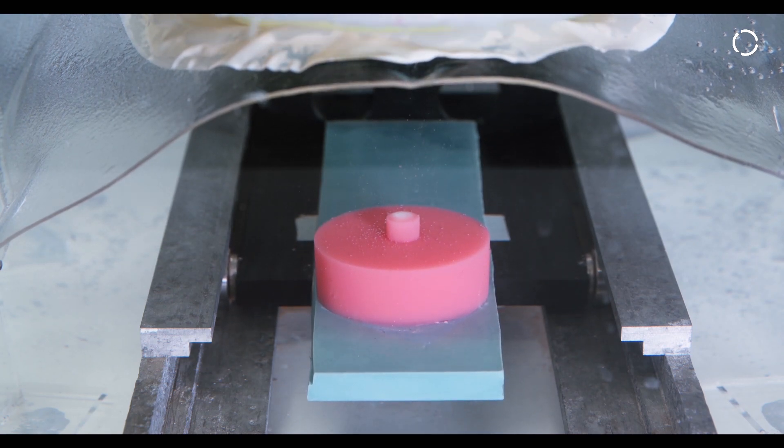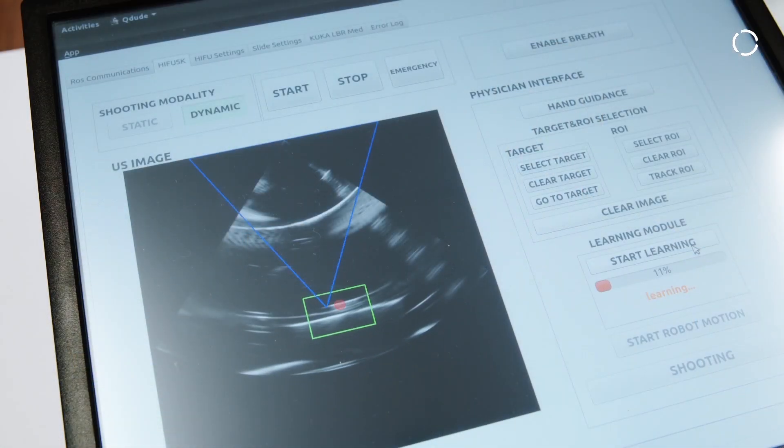We have validated the Hyphus platform both in dry lab and ex vivo, and we recently received the approval to perform in vivo on pigs Hyphus robotic treatments both on non-moving organs like the uterus and on moving organs like the kidney.